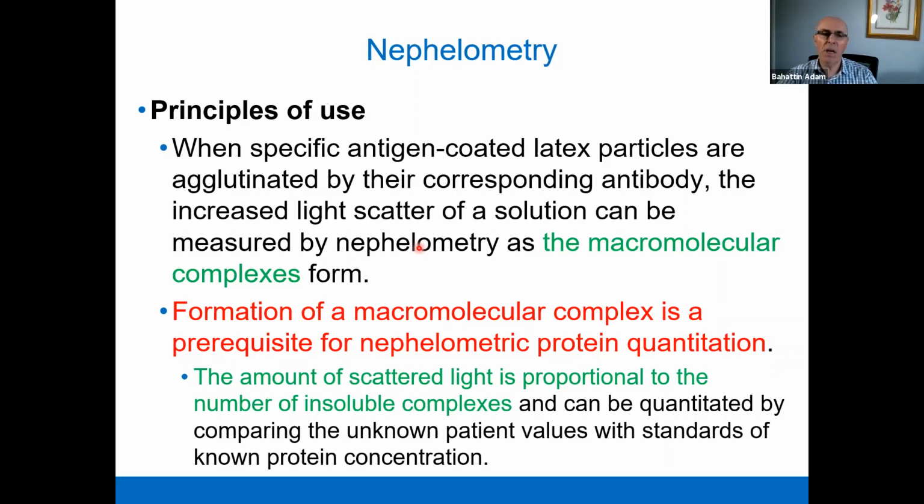If you want to measure the amount of antigen or antibody in the patient's blood, you will use an antibody for the antigen, or an antigen for the antibody, in the test tube. You put an antigen in the test tube. If there is an antibody, they will make a complex compound, and then precipitate.